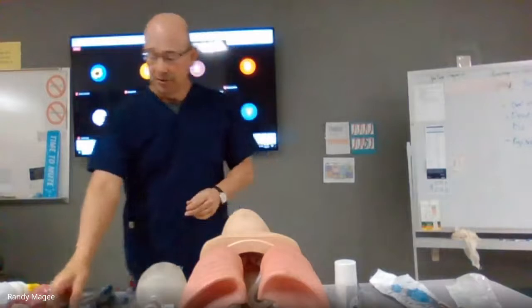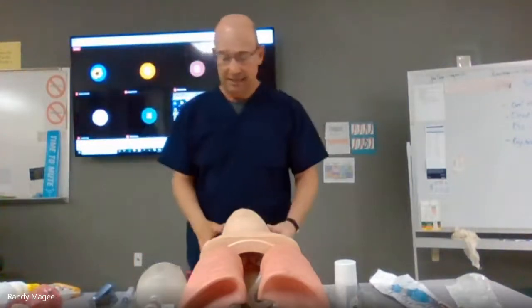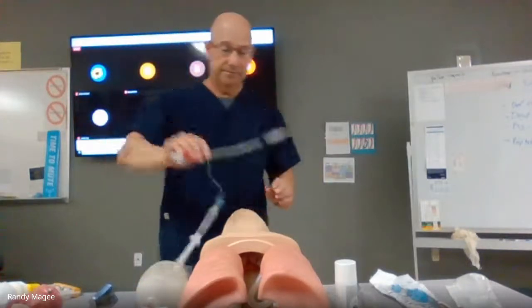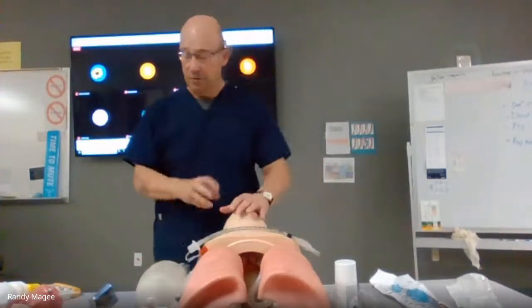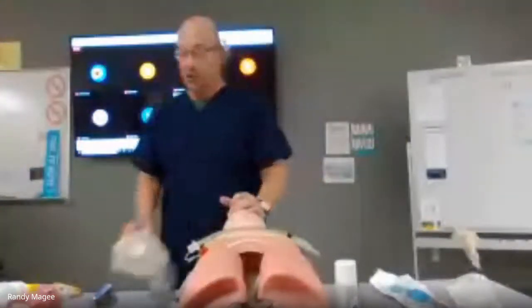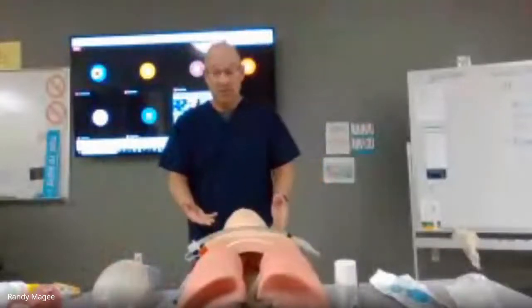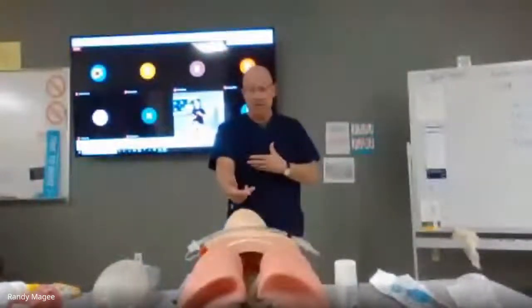So I'm going to intubate here, Fred, with the Macintosh. So I'll get everything ready, okay, and do the intubation here. I'm going to pre-oxygenate with the mask, okay. Make sure to hyperventilate them. This shouldn't take more than just a few seconds because now the patient's not breathing. Whether they're in respiratory arrest or I stop the breathing process, they're not breathing, right?